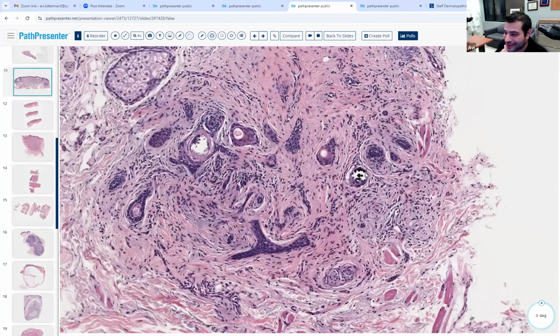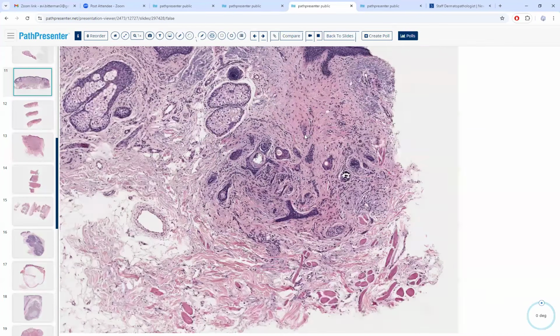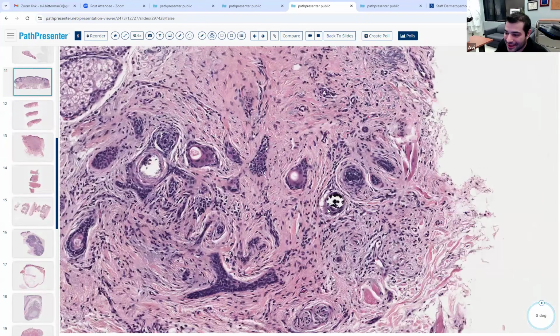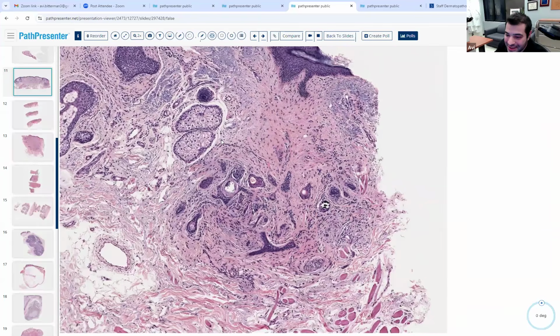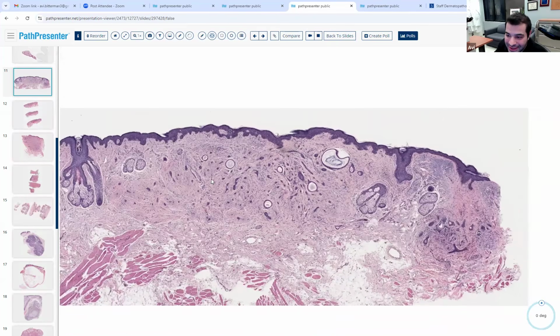What's this little thing here? Calcification? Is that calcification within a duct? It's hard to say what this was because I don't really see anything. But cysts can calcify, and in this case, cysts typically do calcify in this entity.